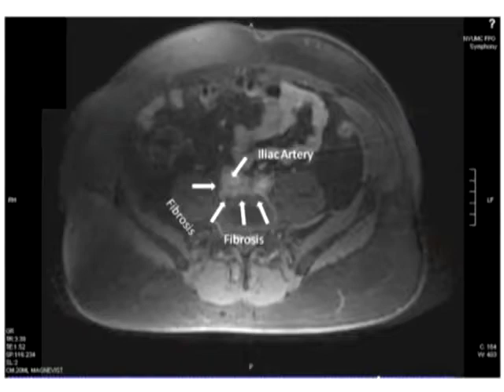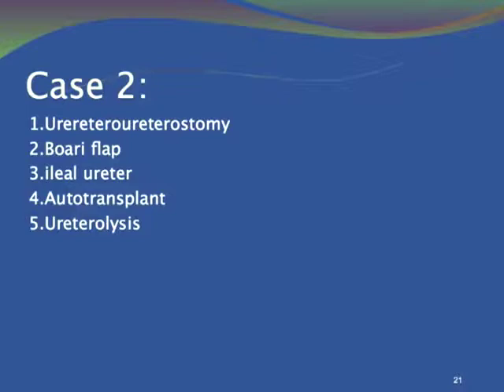In this patient we performed a ureterolysis with omental wrap. However, he was consented for all possible procedures in case this procedure was unsuccessful or failed.